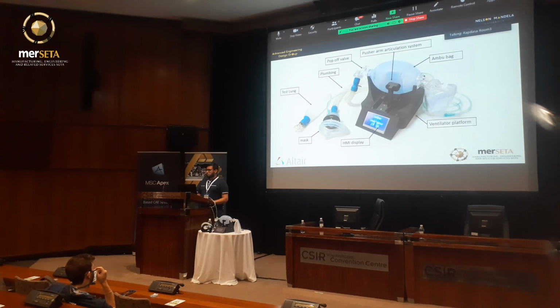The results dictate that even under the over-conservative testing scenarios, the pusher arm will still perform optimally without failure under any reasonable circumstances. The initially selected concept design pusher arm was adjusted during the design process to accommodate the standards of industry, to allow for a more dynamic, customizable design with further reaching applications. From all the tests, calculations and simulation studies, it has been proven that the pusher arm has more than adequate strength and therefore has passed all the necessary specifications needed to be used as a component in the ventilator assembly.